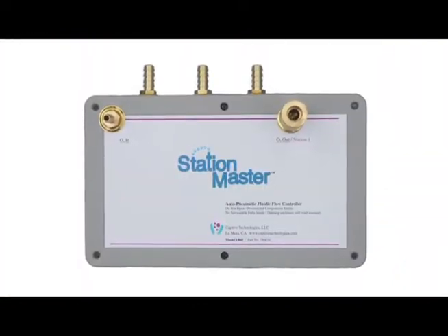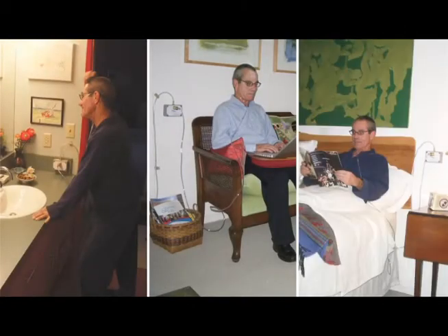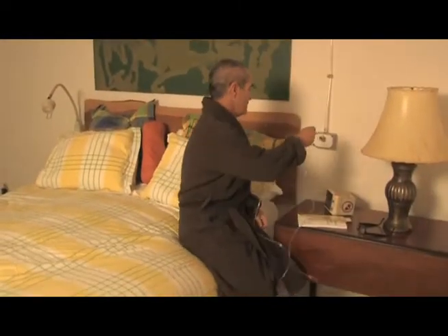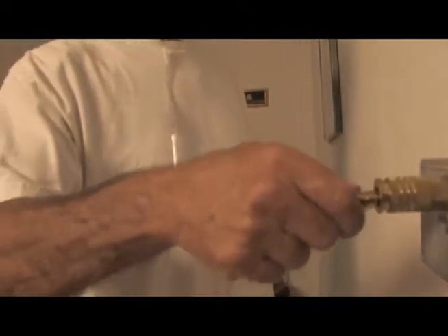StationMaster gives you up to four separate oxygen outlets from a single source. You can have one in the bedroom, the dining room, the TV room, or anywhere within 100 feet of your oxygen source.